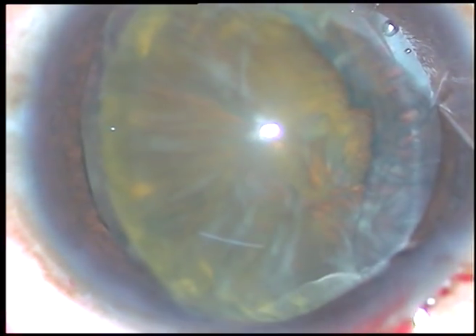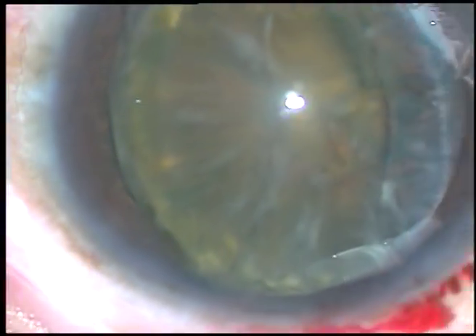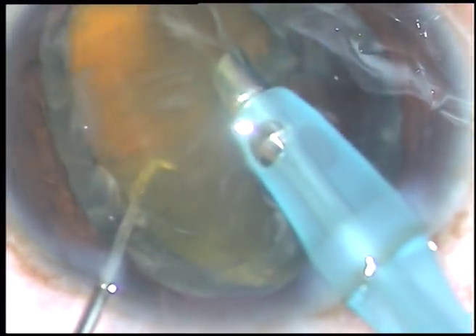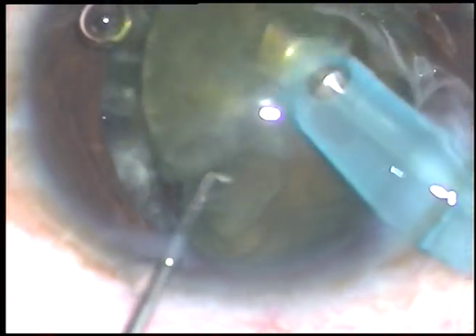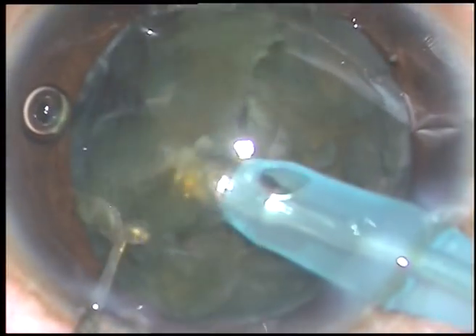Some viscoelastic is injected and now the tip of the phaco handpiece is introduced into the anterior chamber. The bevel of the tip faces the nuclear mass, and I cut a portion of the nucleus and emulsify this portion.